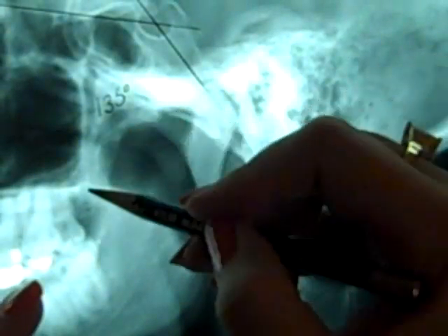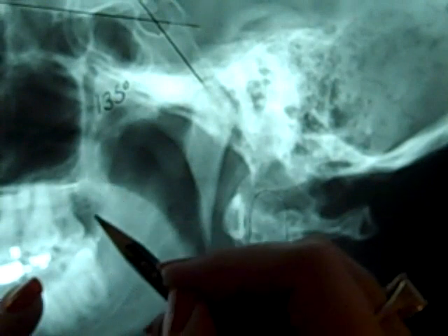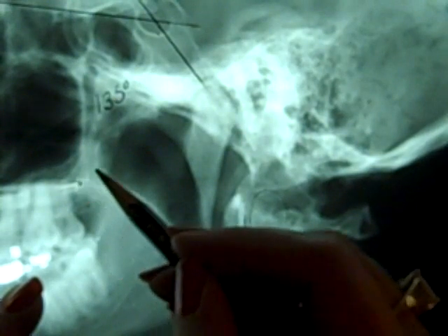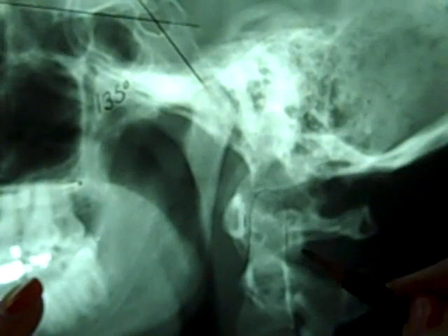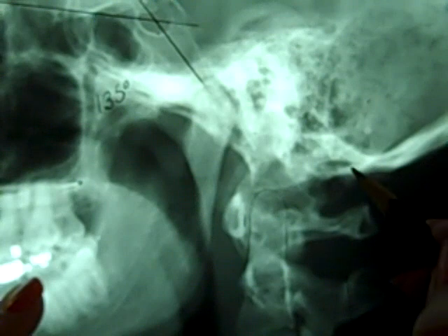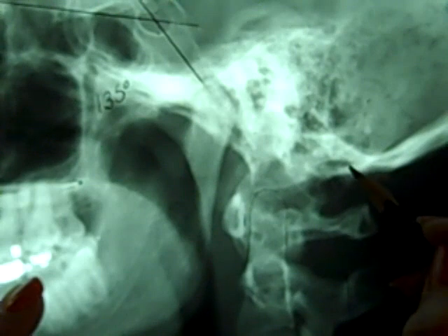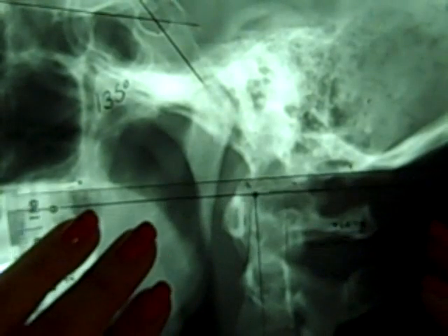Chamberlain's uses the posterior aspect of the hard palate. So again, that's this structure right here, not the superior aspect, but just the posterior aspect. So you see how close that would be as far as what it would appear to be on a film. And it also uses the posterior aspect of the foramen magnum. Now this can cause hardship for some people, but if you follow the back of the lateral mass, which is this structure right here, if you follow that up, you see that there's kind of a sideways U shape right there, and that is the posterior aspect of the foramen magnum. So we draw a line using those 2 points.